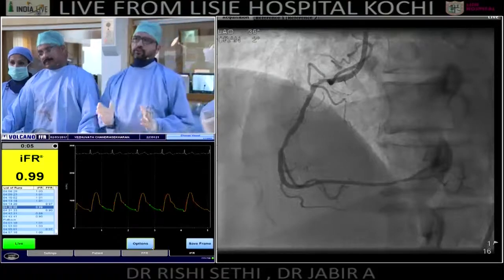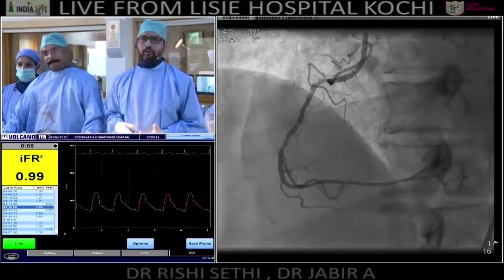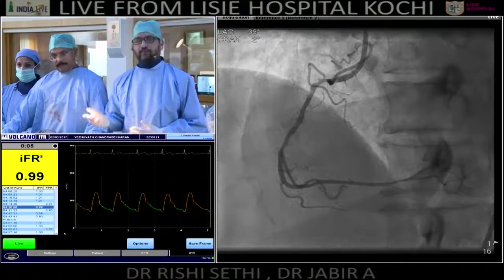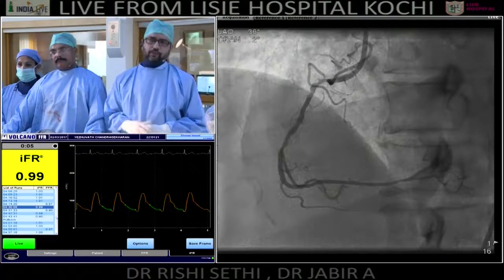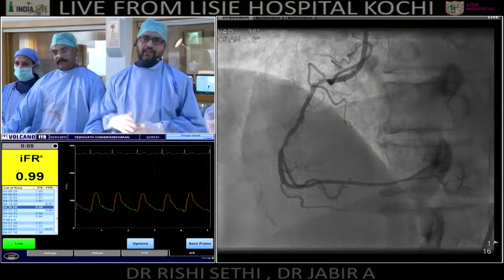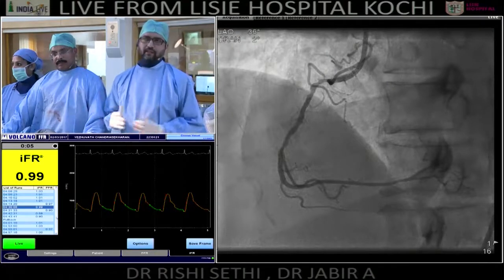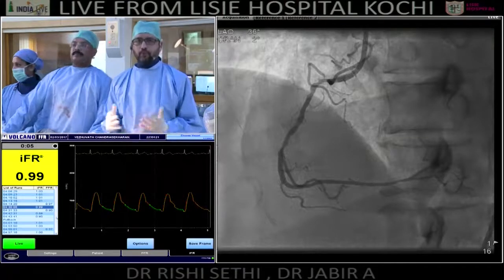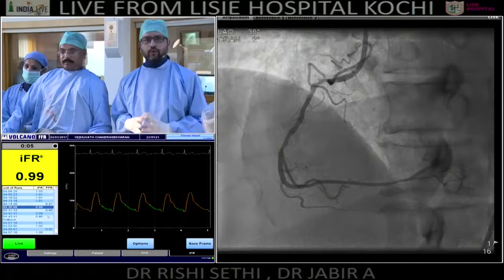Since it was not an acute coronary syndrome situation, and after repeated functional testing, we repeated the IFR a good three to four times and the FFR two times, it didn't show any significance. Retrospectively we realized that the beauty of functional testing is not the lesion itself, but the amount of myocardium that it's supplying. This RCA doesn't seem to be all that great, especially since the OM is a huge OM supplying a pretty large territory of the lateral wall. The PLVs here are not very great.